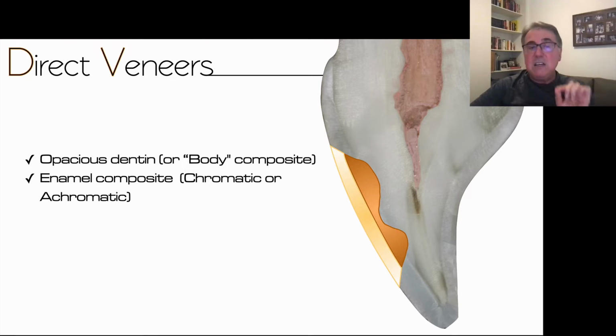So sometimes the opaque dentin composites have a very high value. And depending on the tooth, depending on the case, if they get too close to the surface, and if the value of that composite is too high, you can also have a white spot from the composite. So sometimes you can use a body composite. Body composites are those composites like you have at the V350 or Supreme from 3M, and also Forma from Ultradent, okay?